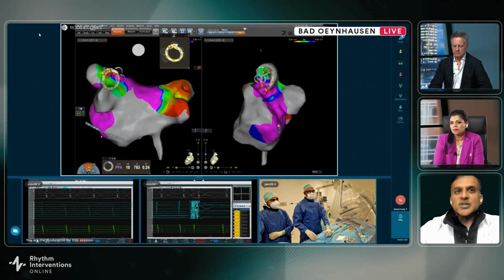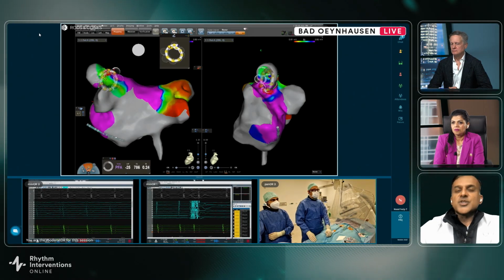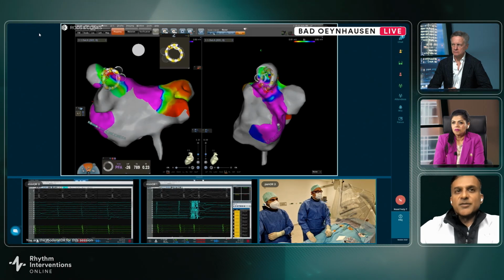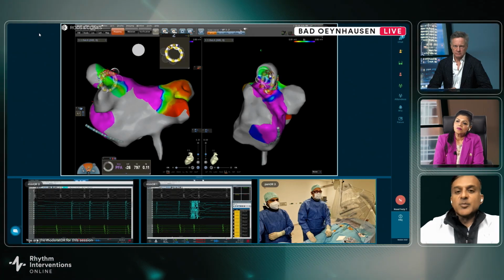Certainly, Krishnan, you seem to have a lot of experience with the catheter with 4 cc's with very good safety margins. I think that in the United States, the 30 cc flow rate was recently FDA approved as on label. It was kind of off label before that.